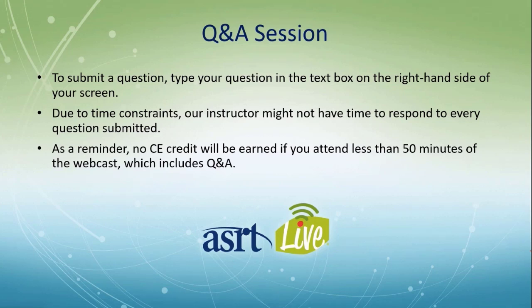Absolutely. A certain minimum kVp is necessary to penetrate the anatomy. But that's kind of a secondary question to whether higher kVps create too much scatter or not. But yes, there is a minimum. And what we've done in several of our textbooks, myself and a few other authors, is we've taken that 15% increase recommendation, and we've made a new chart of optimum kVps, which are in general 15% higher than they used to be.